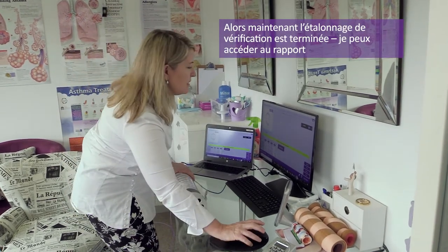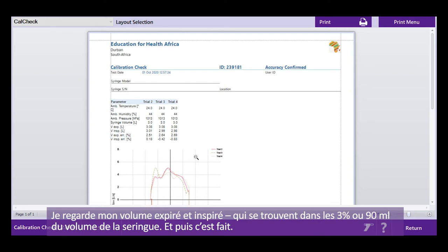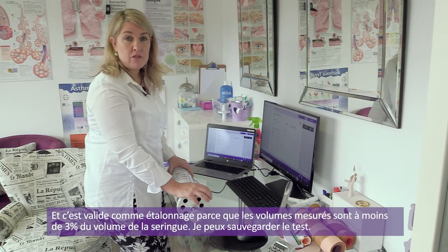The calibration check is now completed. I go to my report and assess it by looking at the date and time, which is correct. I look at my ambient conditions, which are all within the ranges allowed. I look at my volume expired and inspired, and I can see they are within the allowed 3% or 90 mils of my syringe volume. This calibration is valid for volume.